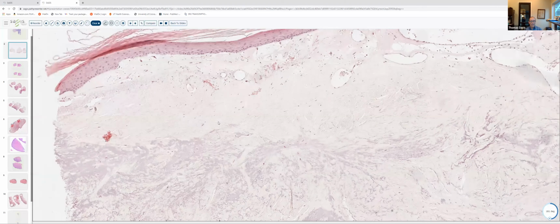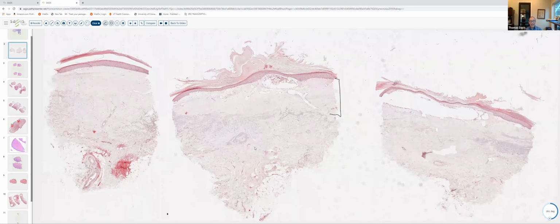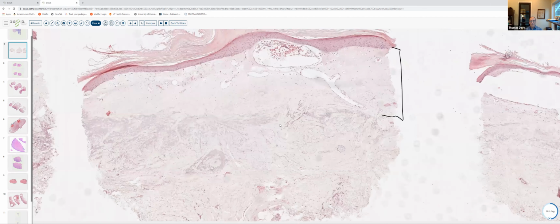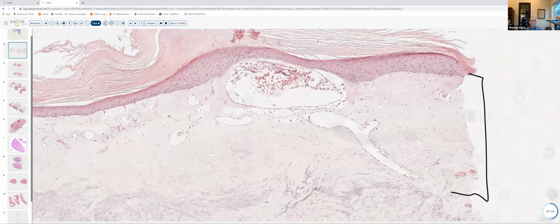I'm going to back out a little bit here because what's notably absent in this biopsy, which was present in the last specimen that we looked at, are, one, an inflammatory infiltrate. So take a look, there's no inflammatory infiltrate here in the dermis. And two, there are no adnexal structures. They're gone. In addition, a couple of notable things in this biopsy specimen. We have widely ectatic vessels. These are much more dilated than we saw in lichen sclerosis. You can see them in the papillary dermis. They're variable in size, but much more widely dilated. They are lined by uniform endothelial cells.